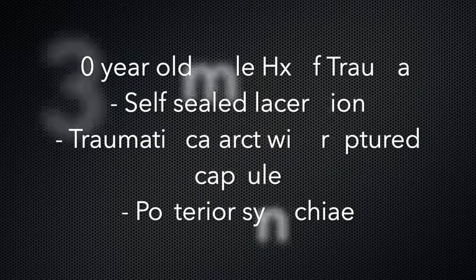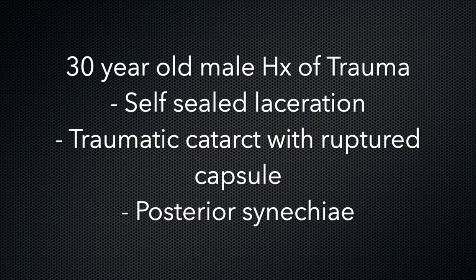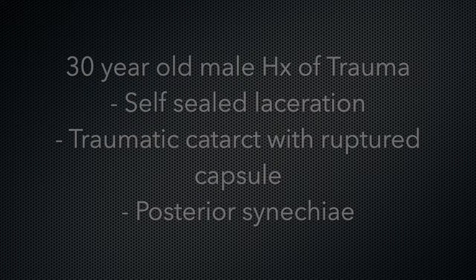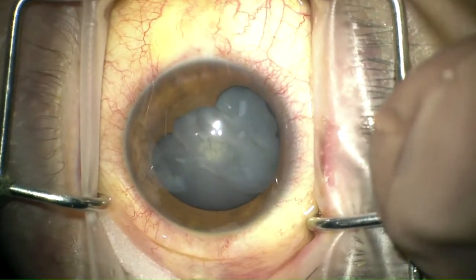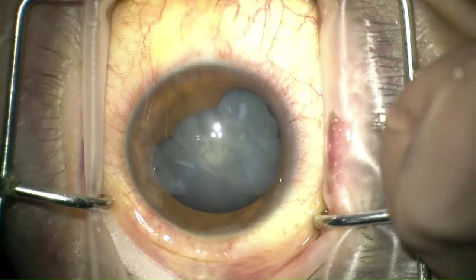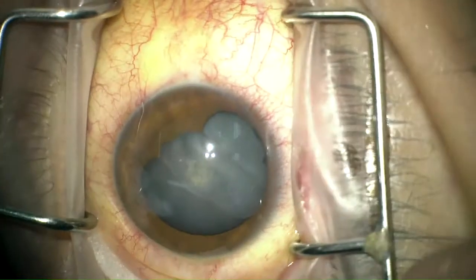This is a 30-year-old male with history of penetrating trauma to the cornea resulting in a self-sealing corneal laceration, ruptured anterior capsule with formation of traumatic cataract and posterior synechia. The aim of the procedure was to release the posterior synechia, aspirate the traumatic cataract, and implant an intraocular lens.